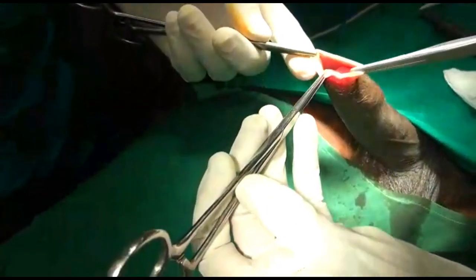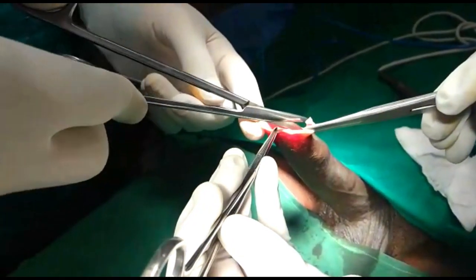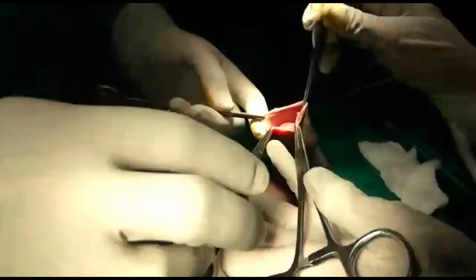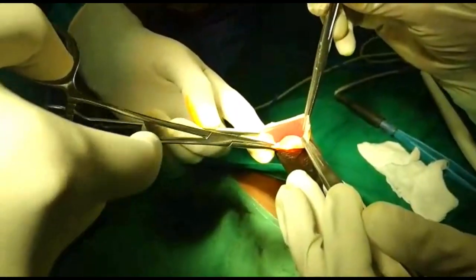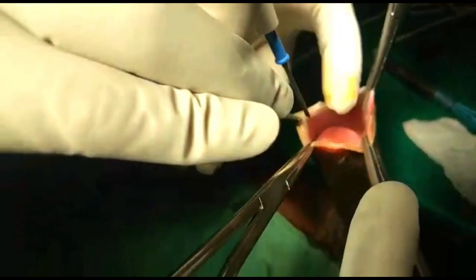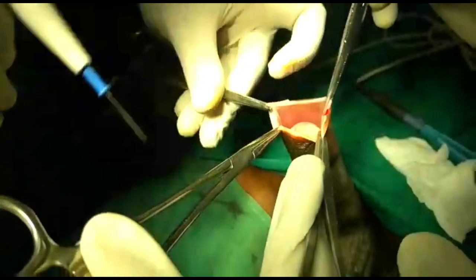What I am going to do is start by opening up the foreskin here. I am going to put snap artery forceps here, and this helps. I am going to try and release it slightly here, to loosen this — just loosen that area a little bit.